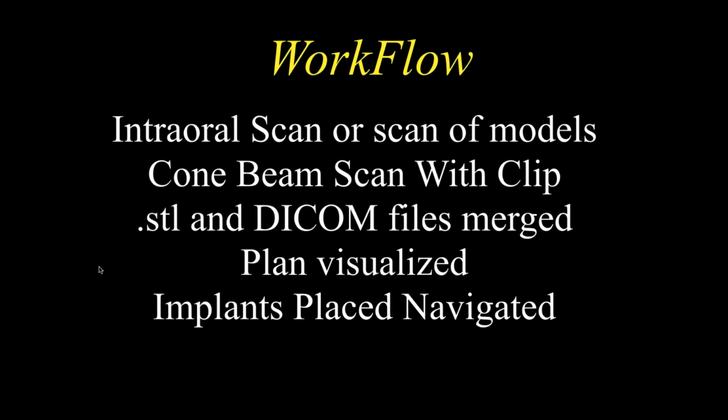So our current workflow is to take an intraoral scan or scan of the models. If you have a model set up, that's great. And then take the cone beam with a patient tracking array or clip, and then put these files together and visualize the plan, and then put the implants in. All of that planning on the CT and on the computer, this is done on the actual navigation computer itself, which is, I use XNav. It's all in there. It takes me 10 minutes, literally 10 minutes. I had a half hour to wait before doing this, and I went and did it, a couple cases just to get them set up.